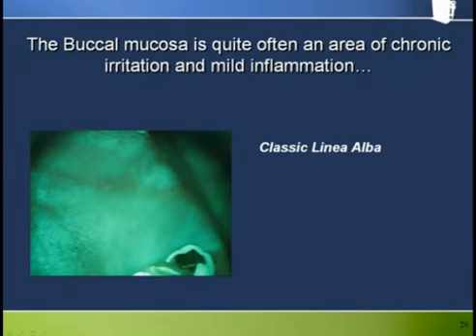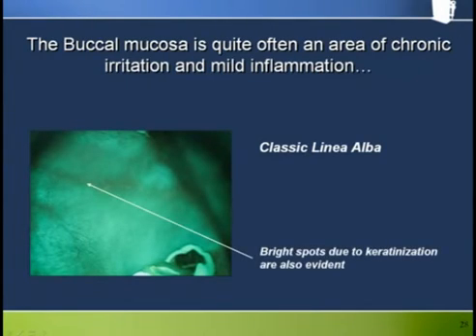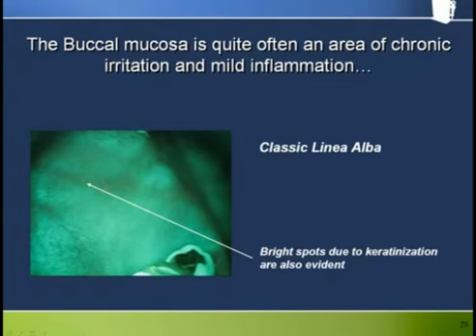Buccal mucosa is quite often an area of chronic irritation and mild inflammation. Here we see a fairly classic presentation of linea alba under Velscope. Under white light, you can see a white line corresponding to keratinized tissue right along the bite line. This can sometimes show up as a bright line under Velscope due to keratin fluorescence, but more typically appears with the associated mild inflammation dominating and showing the area as predominantly dark.